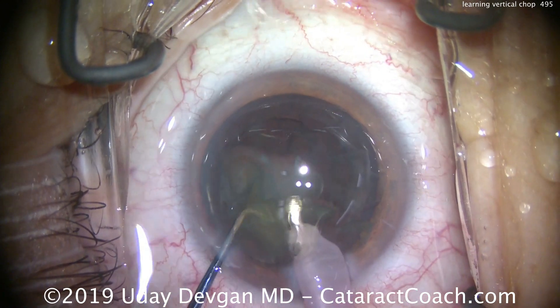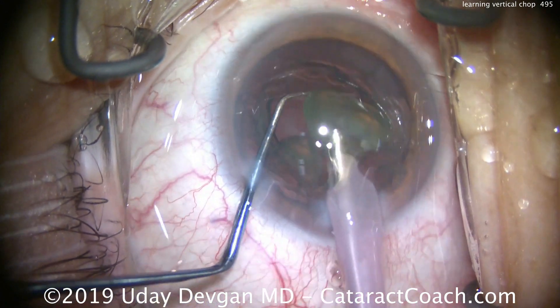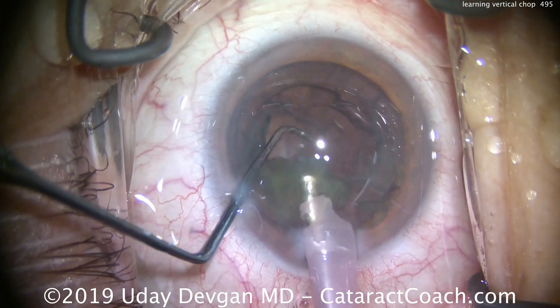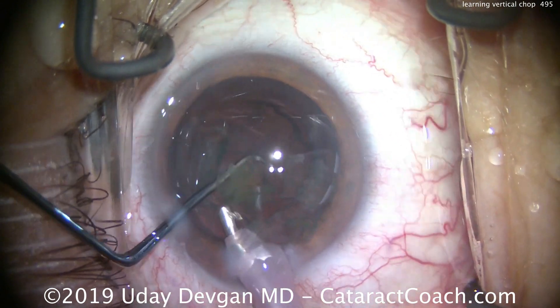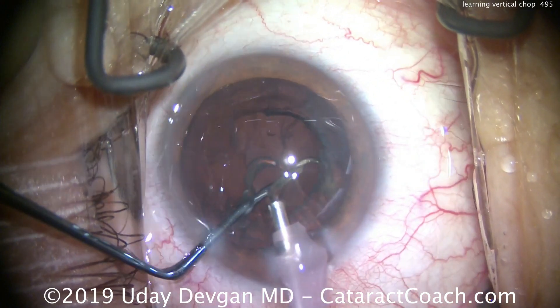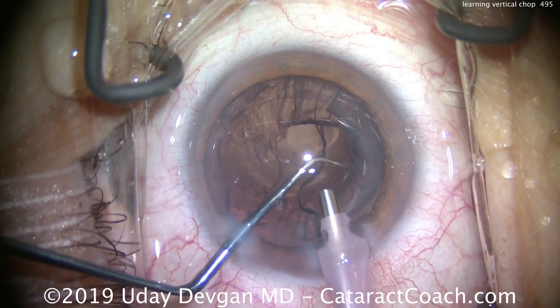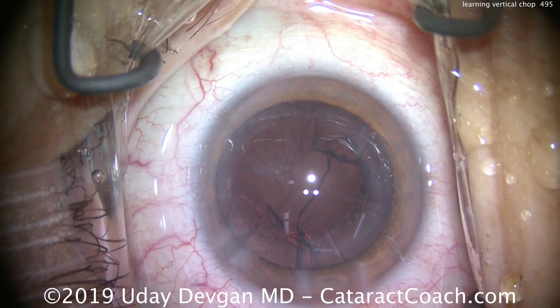In real time, you can certainly remove this nucleus from the eye in less than 60 seconds with a bare minimum amount of phaco power and very little fluid going through the eye. You can remove cataracts with just 25 cc's of fluid, which is very gentle and minimally traumatic to the eye. There we go — nucleus is done.